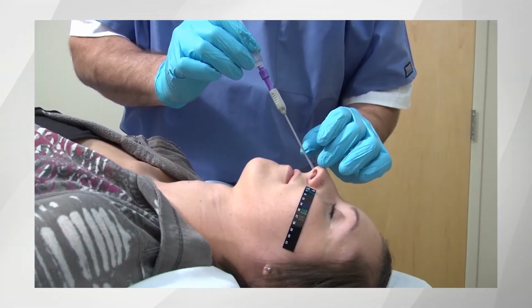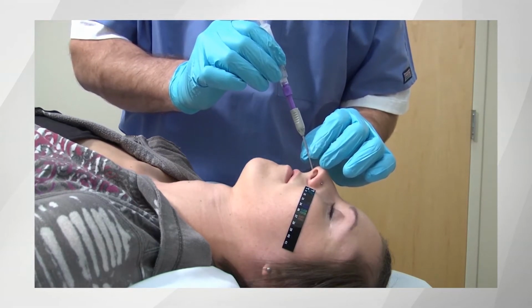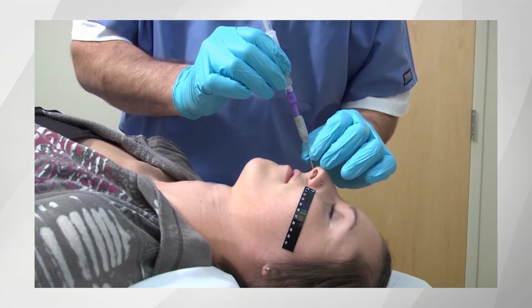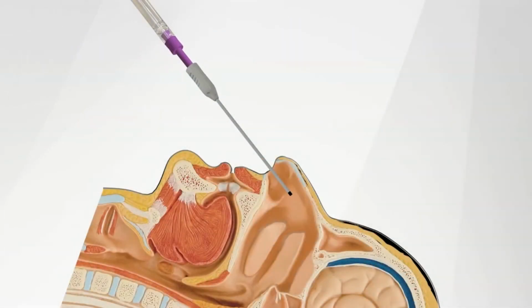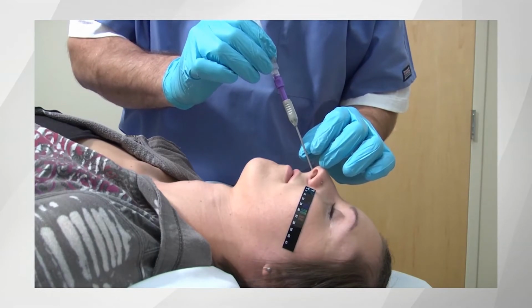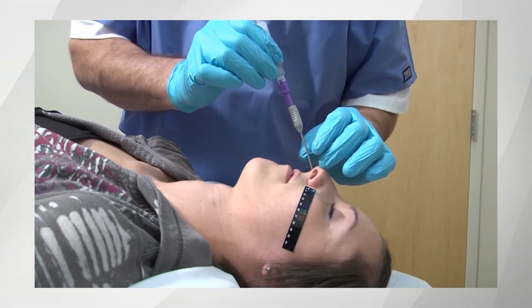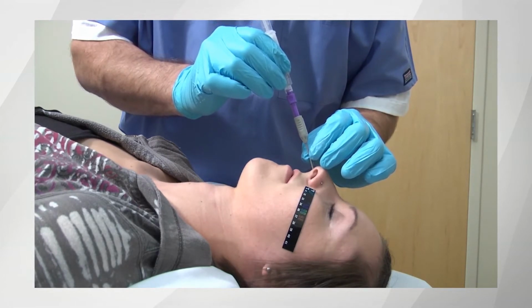Inform the patient that you're going to gently insert the SphenoCath into their nose. With the directional indicator pointed towards the ceiling, the SphenoCath is inserted through the nostril and nares. Using the non-dominant hand as a guide and anchor is very helpful. Gently place the tip of the middle finger on the tip of the nose and let the catheter glide between the tips of the thumb and forefinger.